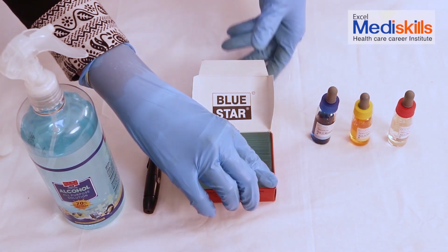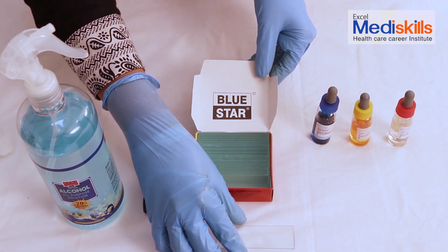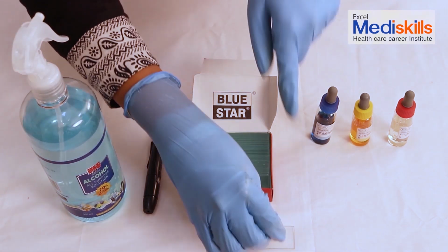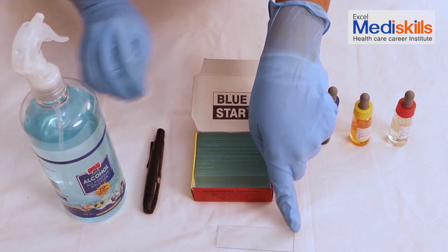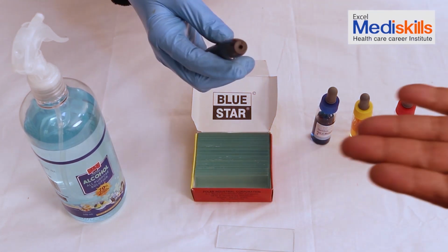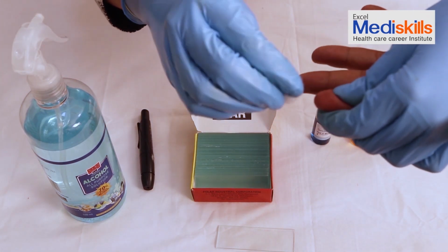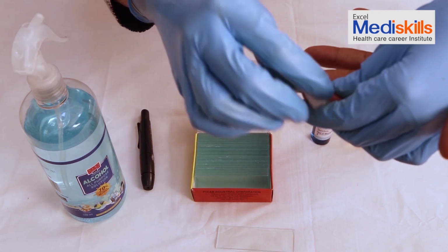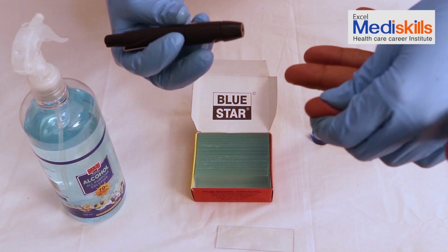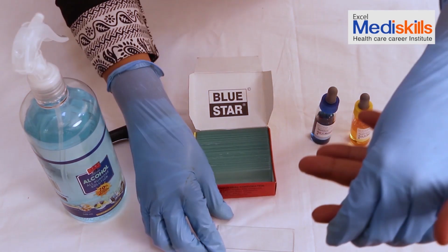In the second case, we again take a glass slide carefully. We again disinfect this with the help of this disinfectant like this. After that, we again take a new sterile needle and prick the patient's finger with this. Before that, of course, we have to disinfect or sterilize the patient's finger. In the next step, we press the finger and then prick that area.